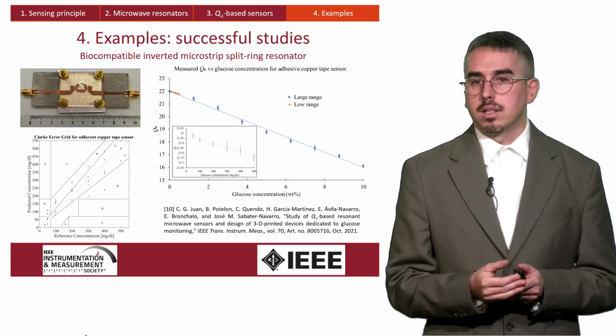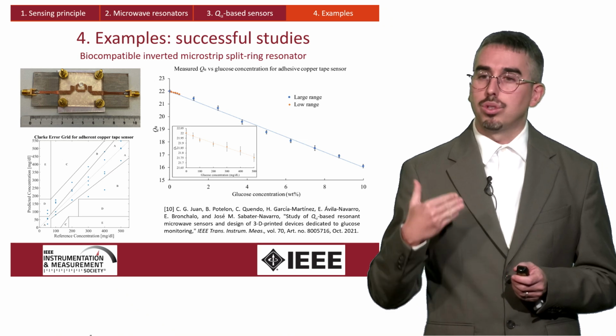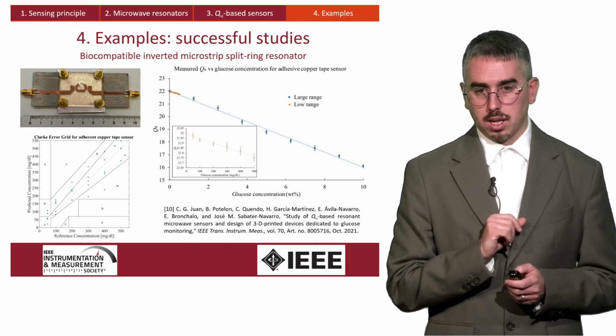We can see that the results show good linearity, good sensitivity, high enough to discern very low quantities of glucose concentration of interest for the diabetes domain.